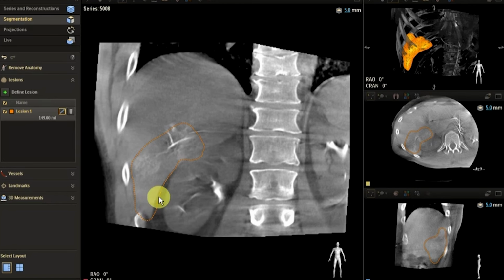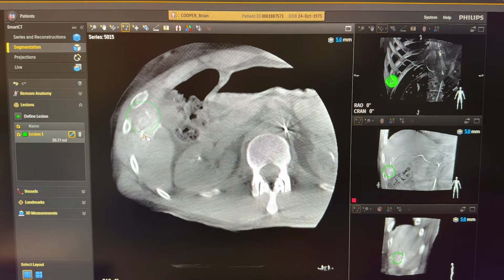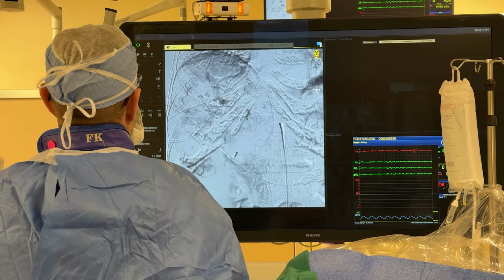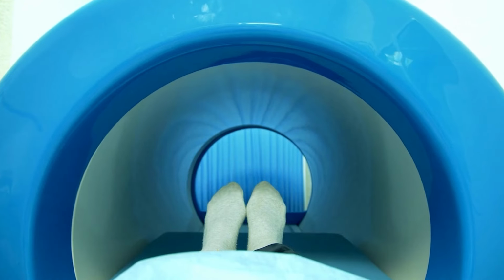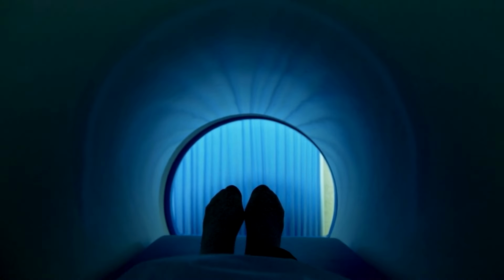And we can do a 3D image and in real time calculate the volume of the treatment zone. And based on the volume of the treatment zone, we know how much radiation we need to kill that segment. We even simulate the radiation delivery with an agent called technetium to see if it might go to the lungs or to the GI tract, which helps us plan a safe and effective dose for the treatment. Immediately after we complete the angiogram, which is the part where we insert the catheter, inject the dye and measure the volumes, you go to the nuclear medicine department and you will spend another 15 minutes getting imaging to see where the radiation, or the technetium that we injected, went.